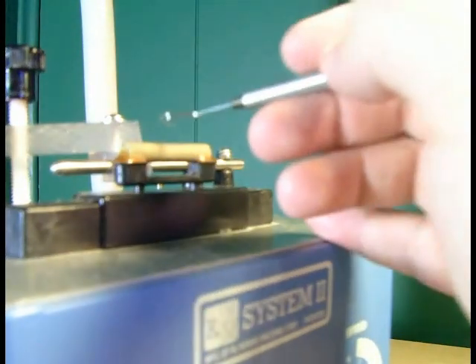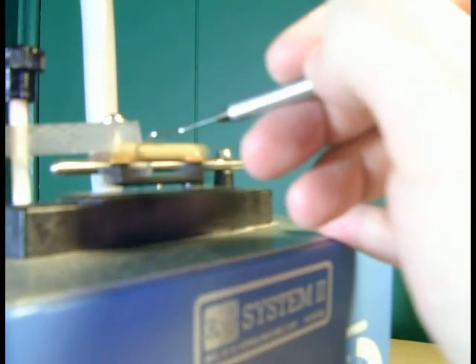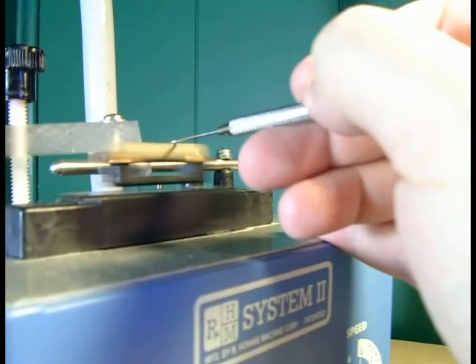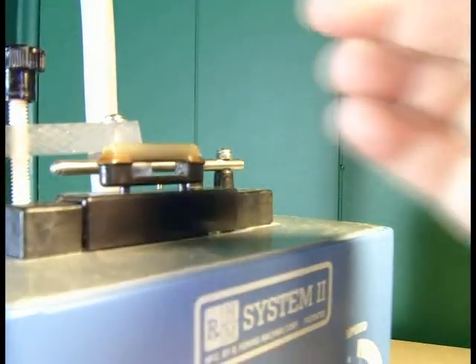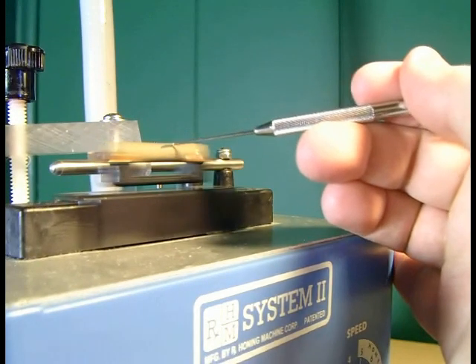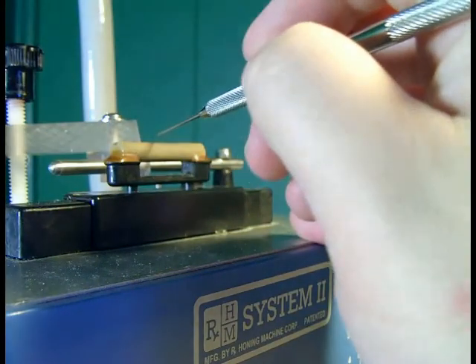The last instrument we're going to demonstrate today is the Explorer. We're going to apply the round hone to the back of the machine, step on the foot pedal, and move the Explorer around the outside of the hone like so, turning it over and doing the other side the exact same way. What this does is it applies a needle point to the end of our Explorer.